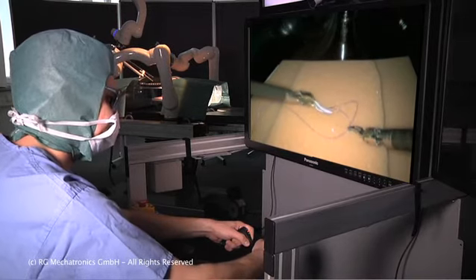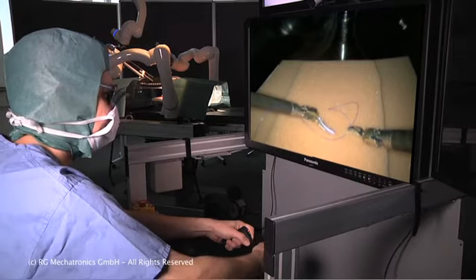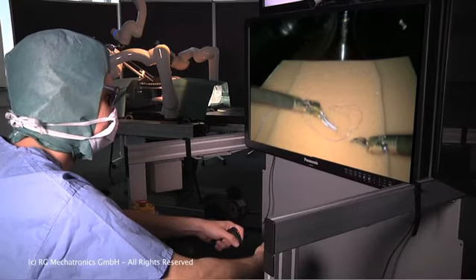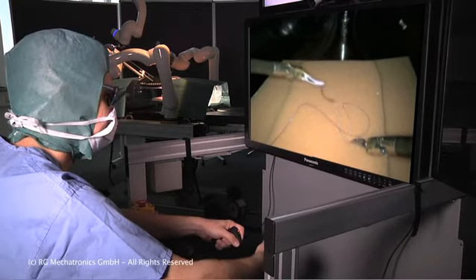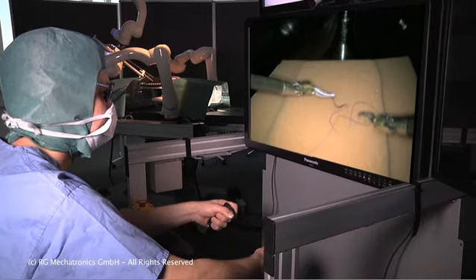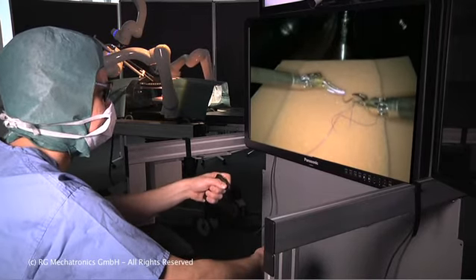The system, as you can see, is made up of two robots holding instruments and one holding the endoscope, from which the three-dimensional picture is displayed in front of the surgeon. This could be extended to 4 or 5 robots if necessary.